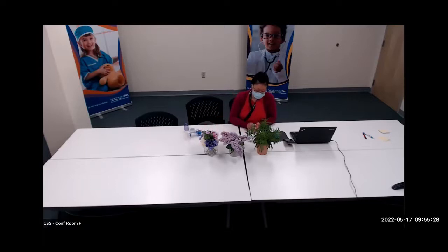And also for those of you who use a lot of these MDIs at home, sometimes the nozzle gets obstructed with the medication itself. It can get pretty gunky in there. A lot of these inhalers, this for example is albuterol, the canister comes out very easily. Now this canister never gets washed. Keep this dry. Put it down, keep it dry.